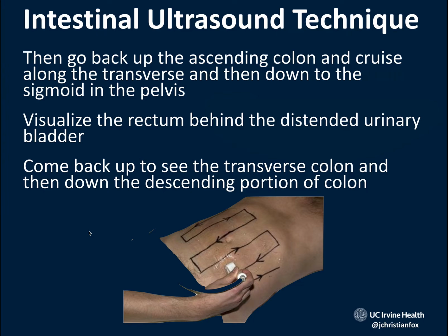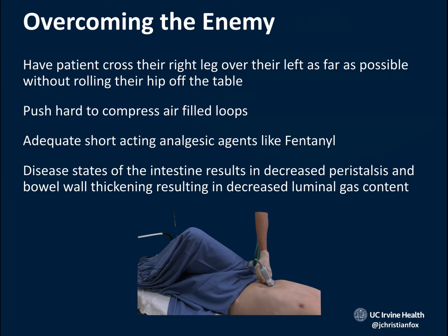And more often than not, you've come up to what you believe is a leading diagnosis, usually 2 or 3 minutes into this exam. Though sometimes this is the one study that does take me longer than most other studies do. I might spend as much as 5 to even 7 minutes performing a point-of-care ultrasound of the intestines. Now, the problem, though, is the air in the intestines. We've talked about that being the enemy of ultrasound.